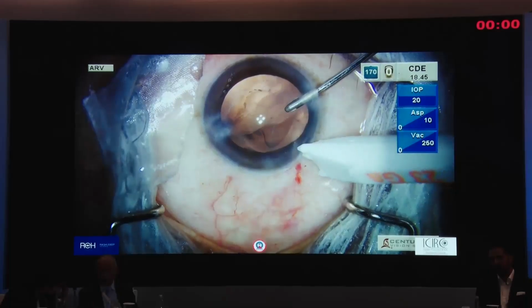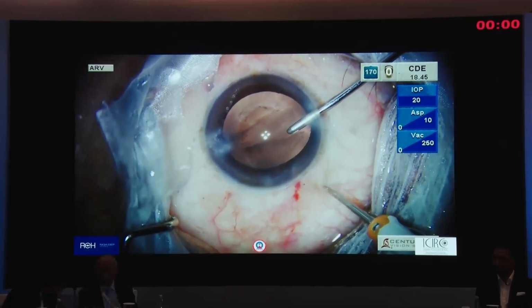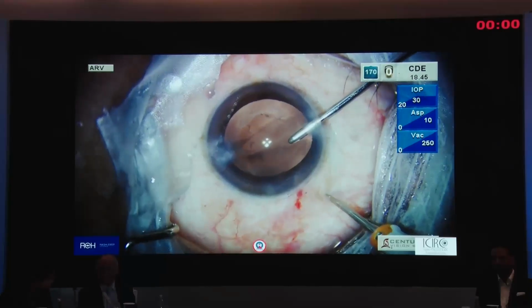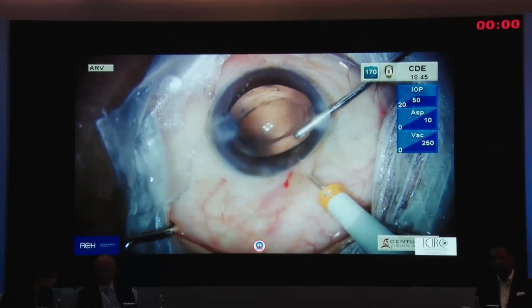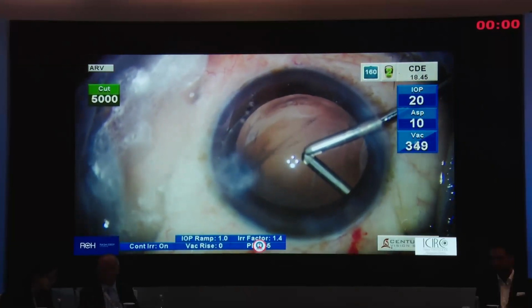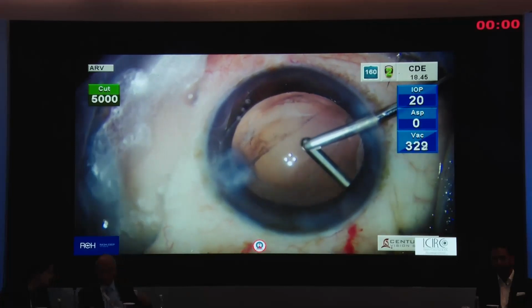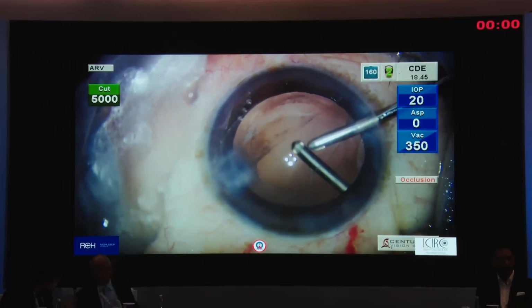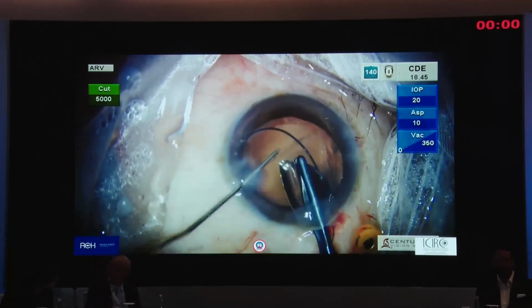But because I suspected a vitreous loss, I'm doing a vitrectomy, and you have an option of doing limbal vitrectomy, both irrigation and vitrector in the front, and also another option, and I find this is useful, irrigation still in the front, but one port vitrectomy. Our aim is to do a vitrectomy not only in the center portion of the eye, but also behind the area of the optic, so that the IOL is supported very symmetrically.